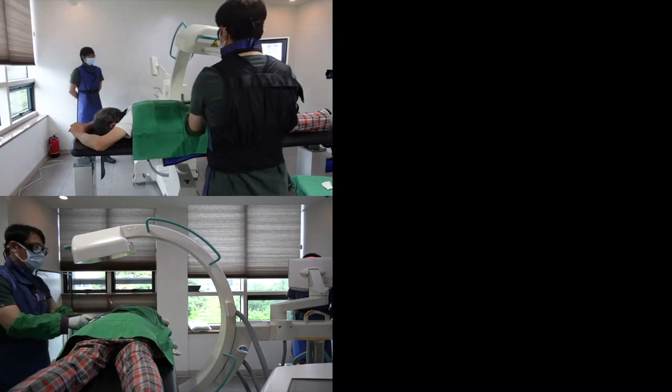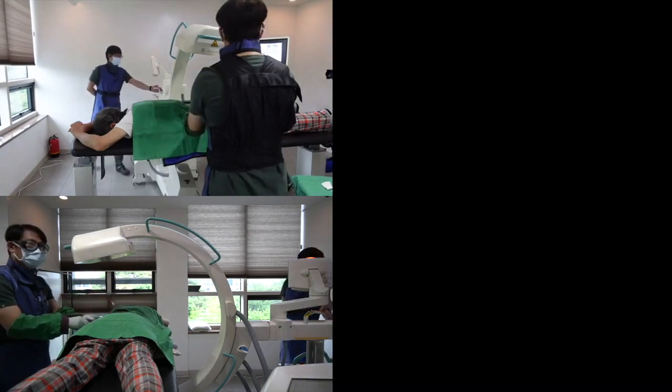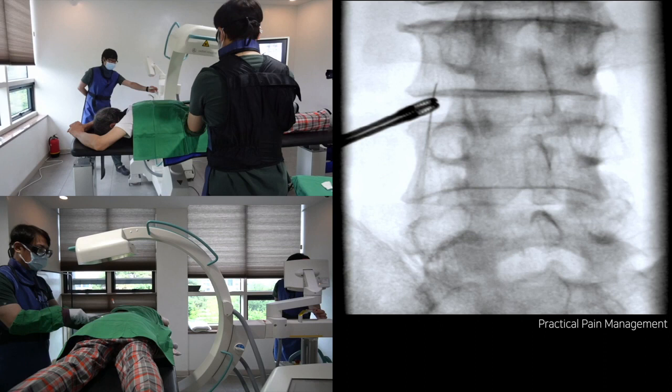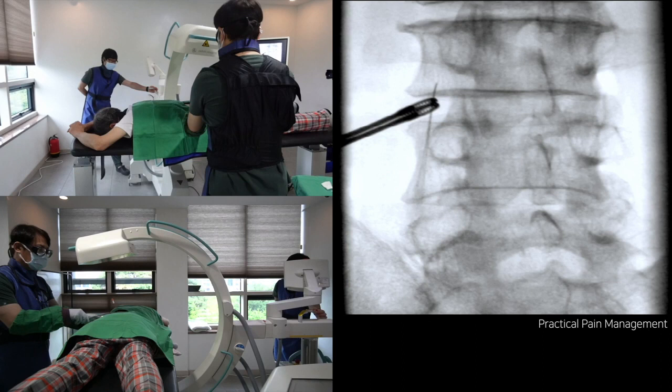Hello, I am Dr. Li of Practical Pain Management. Welcome back. This is the second video that shows how much rotation and tilting I need to find a target and approach the needle. Please check the cranial tilting and rotation in each procedure.